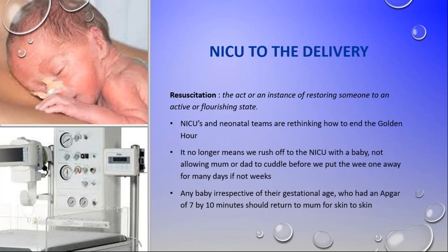Even if the baby's intubated, on the Dräger resuscitator, you are able to actually ventilate that baby and allow those parents 5 to 10 minutes just to breathe. This may be the only chance they have of holding this baby for as long as sometimes 6 weeks. That 5 or 10 minutes it takes out of your day makes the world of difference.